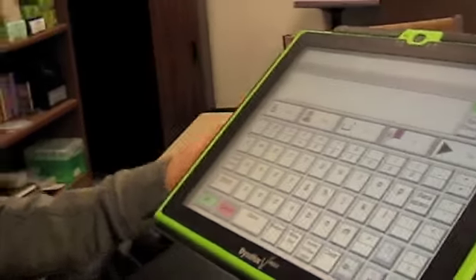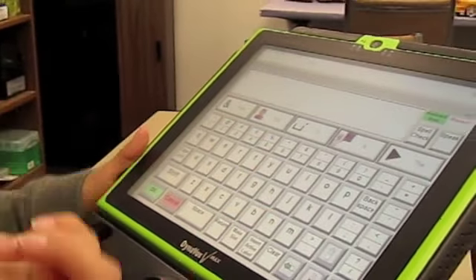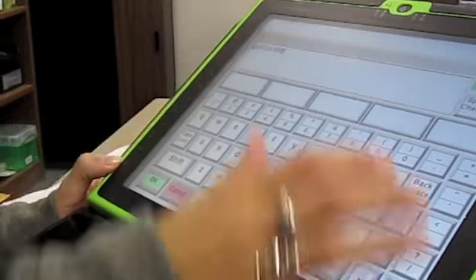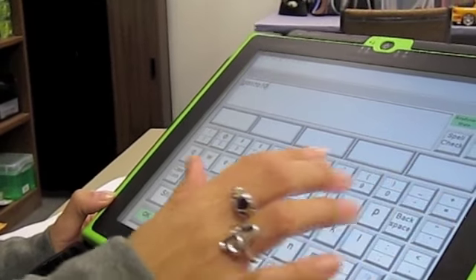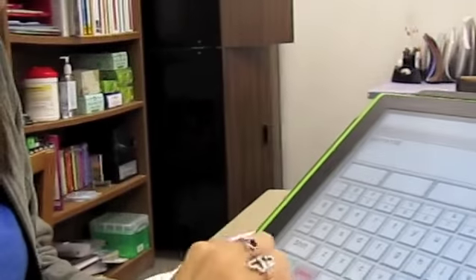You would click your card and then press name, and this is where you get to name your user on your card. You would usually put a name and then a date to help you find it. So I'm going to put Alonzo 10-8. Close that. Okay.